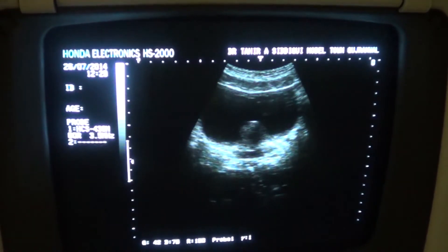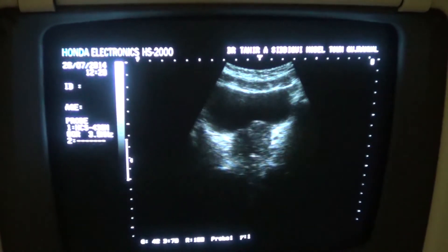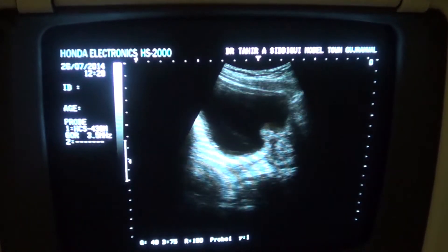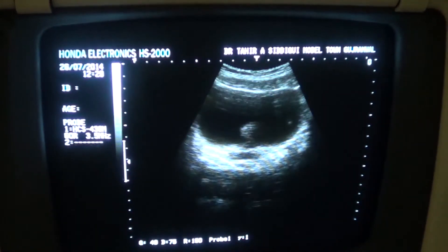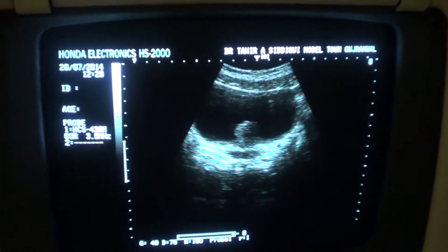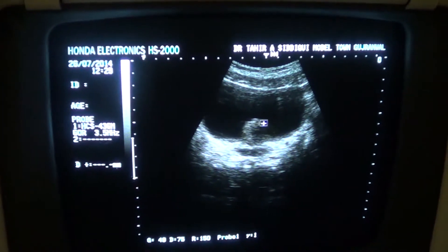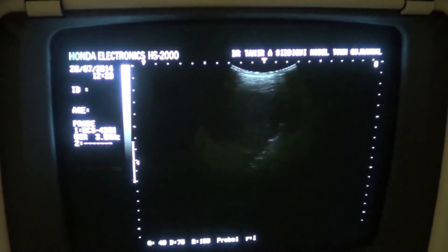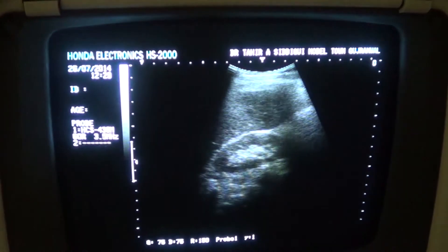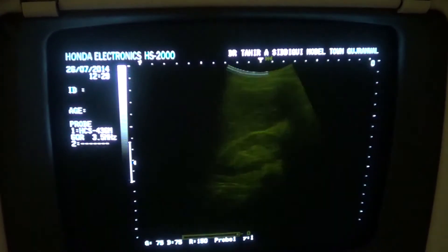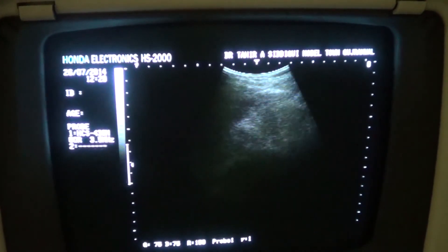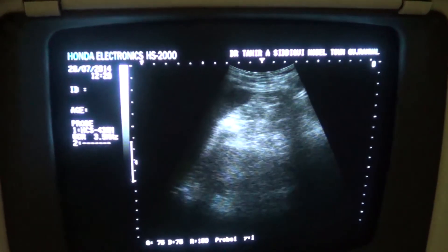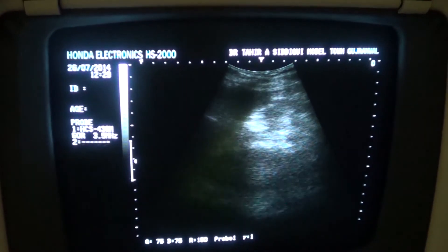This is the case of an enlarged median lobe of the prostate with otherwise normal dimensions of the prostate in longitudinal and transverse sections. The cause of urinary bladder obstruction is the median lobe of the prostate indenting into the urinary bladder. The right kidney is seen normal and the left kidney is also showing no pathology.